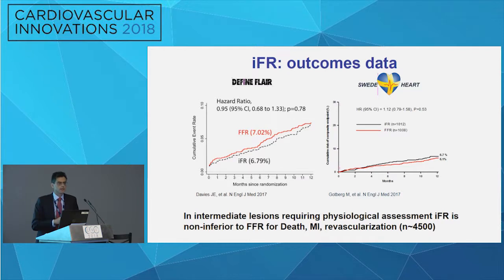Anyone? So then, who believes you can use any resting index with similar outcomes? I think if you took a diastolic pressure index... if you do any resting index, that includes Pd/Pa, and it seems to be a little poorer quality. I think if you took a diastolic resting index, it'd probably be equivalent. Well, to have democracy, you have to vote. I think we all agree.